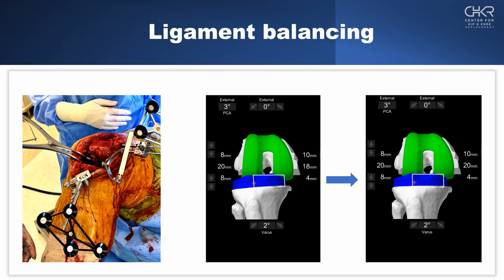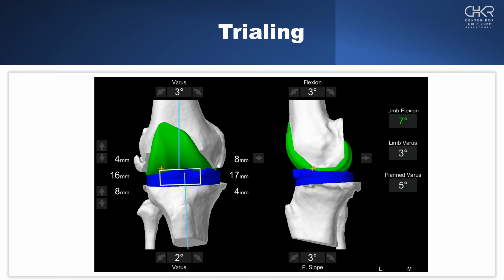I'll then move into extension. So in extension, I'm doing the fine tuning here. So now I brought the flexion contracture over 21 degrees. So I started out with 28, now I'm 7. So now I am almost within a neutral range of extension. I have a 16 and a 17.